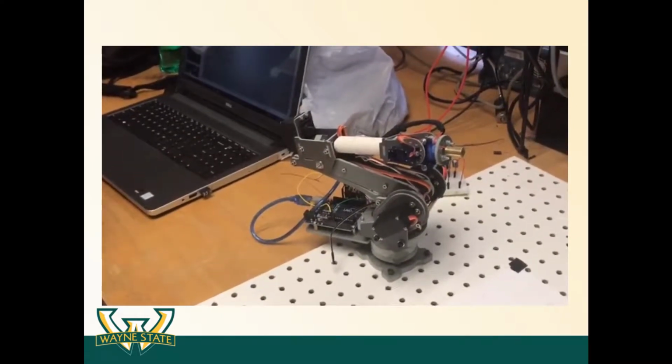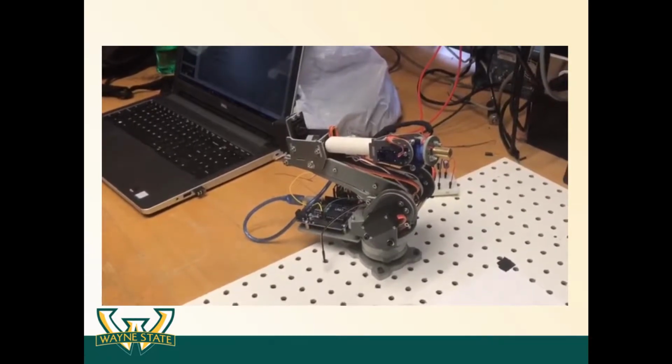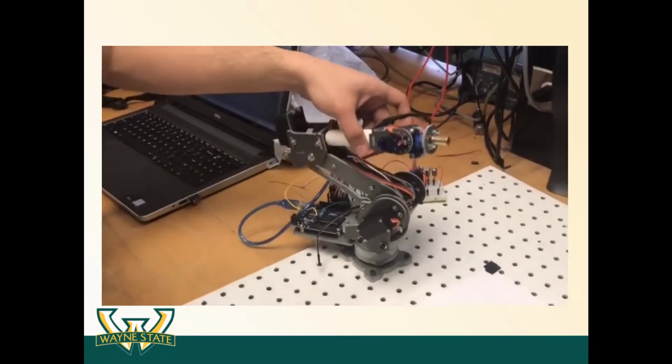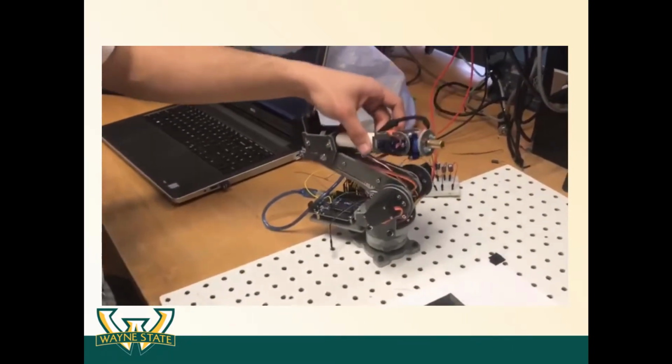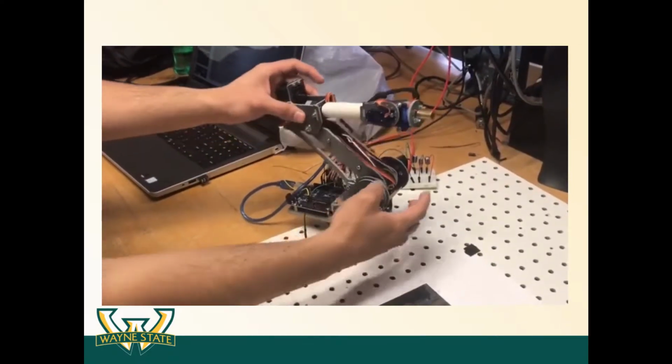Hello everyone, this is group 7 and the title of our project is simulation of radio surgery using a robotic arm. You can see this is our model of a robot arm which has 6 degrees of freedom. This is our first joint, which is the first servo.